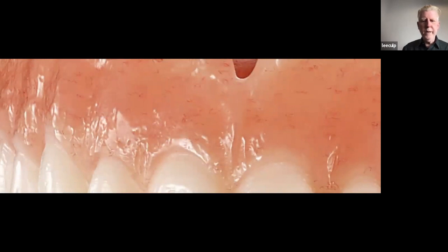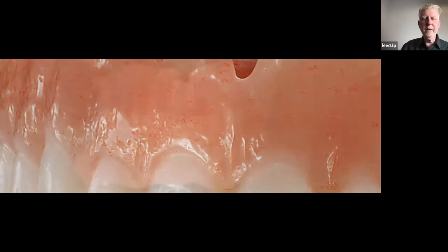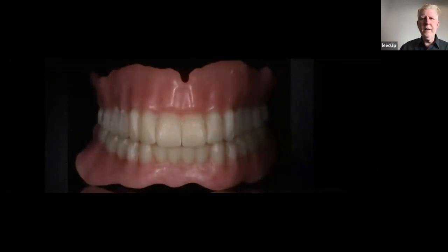So we add the little textures in, all the things that come with teeth and tissue. Very careful pumicing, because with pumice you can actually ruin the denture. The printed materials pumice very nicely, just like the acrylic materials. We get a very smooth surface, but retain all the tiny little textures we placed in on the tissue and the teeth to make them look real.